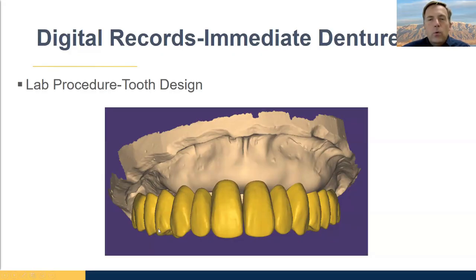Or you can do milled or printed teeth and a milled or printed base. And then the last workflow is there are both printing and milling procedures that allow you to print monolithically. With printing, there's the multi-jet printer that allows you to print both pink and white. And then I think Ivoclar is the one that I know of the most that has multi-shade pucks for milling.